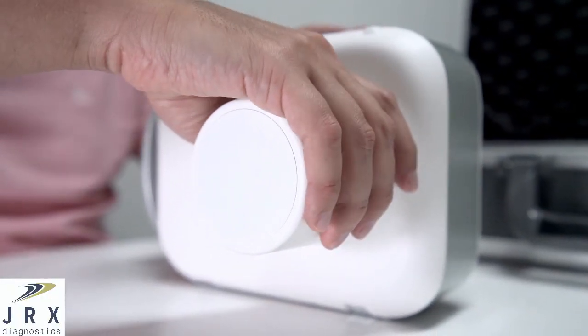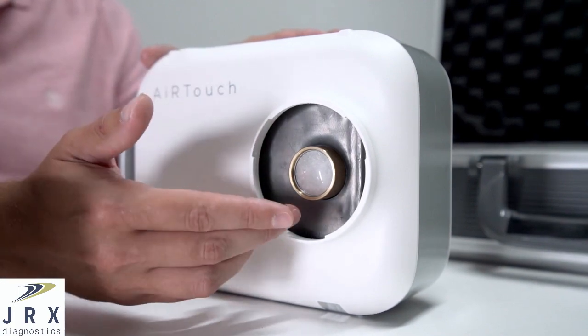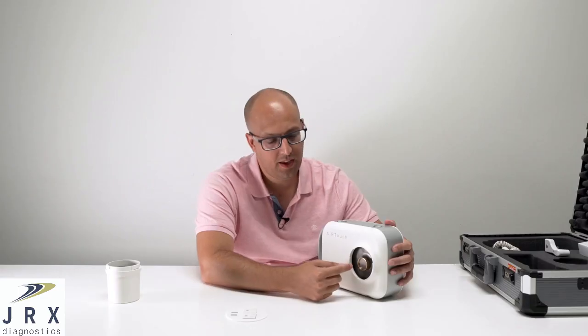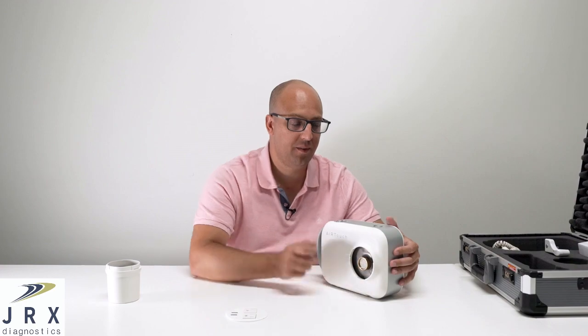Now I'll show you the portable x-ray system. On the inside you'll see that we have an integrated mono source x-ray tube and generator. This uses a Toshiba insert and a 100 kilohertz high frequency x-ray generator.